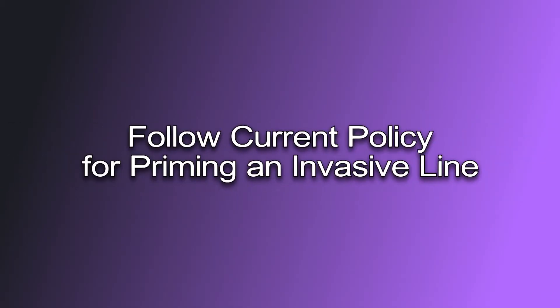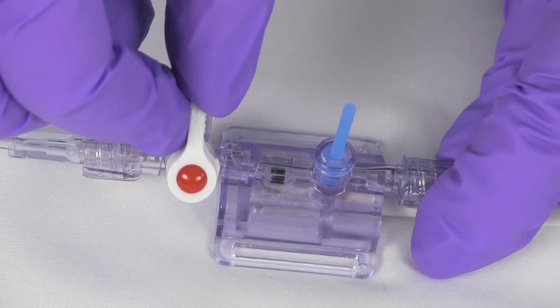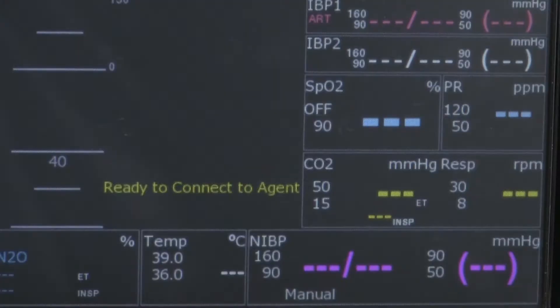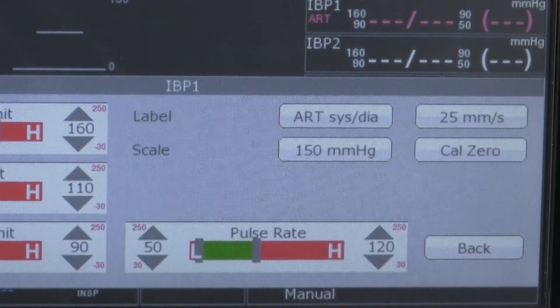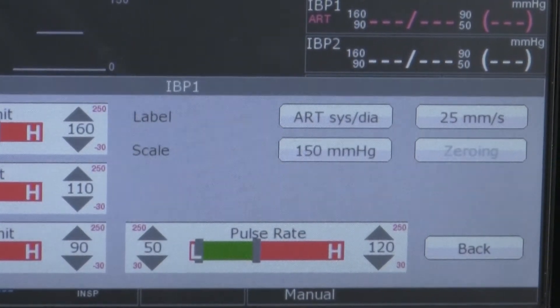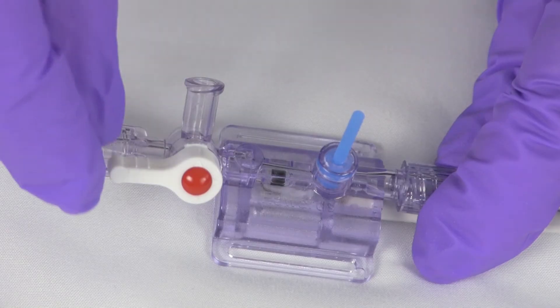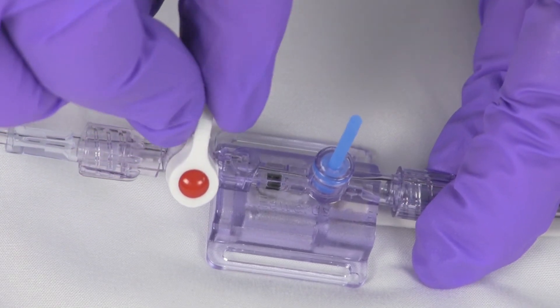The next step is for the user to follow their current policy for priming an invasive line. The user will now calibrate the invasive system to zero. The user will open the transducer to room air, select the IBP 1 or IBP 2 vital sign box that corresponds with the IBP line, and then press the Cal 0 button on the IBP menu. This will calibrate the system to zero. Once the system has been calibrated, press the back button to return to the monitor screen. The user will then close the transducer to start readings.